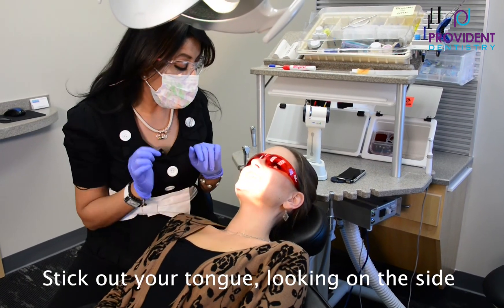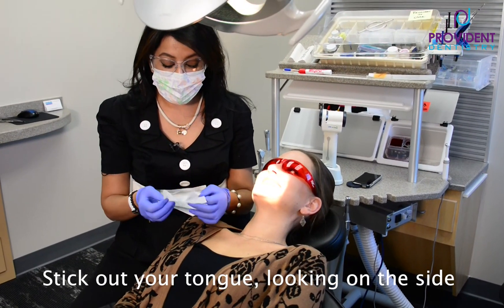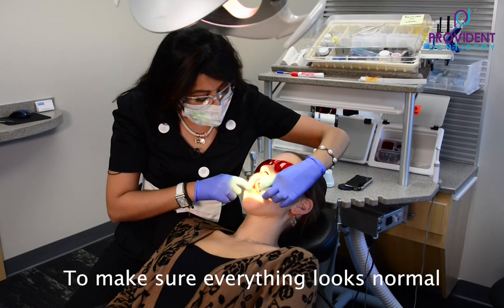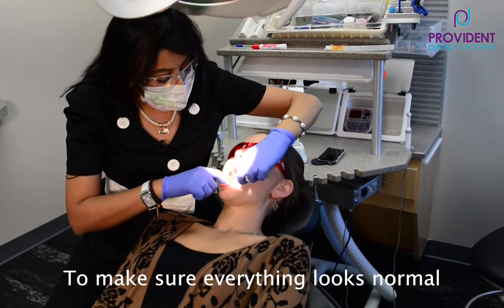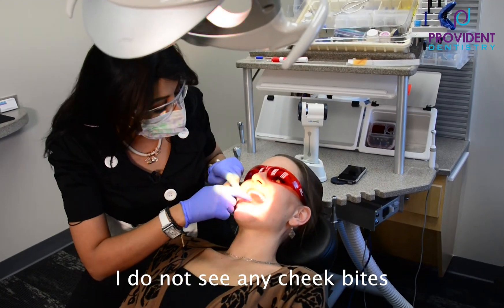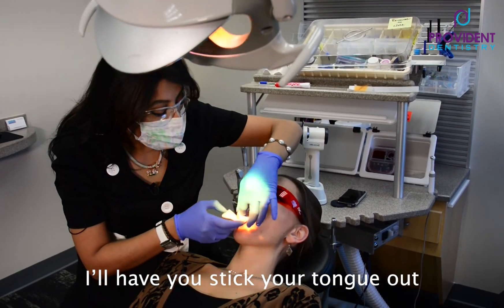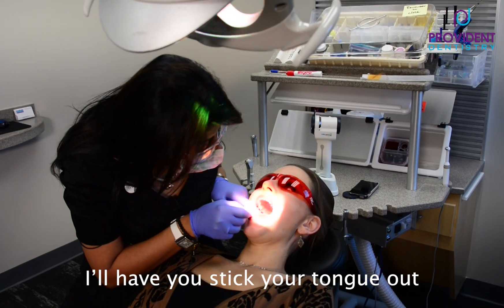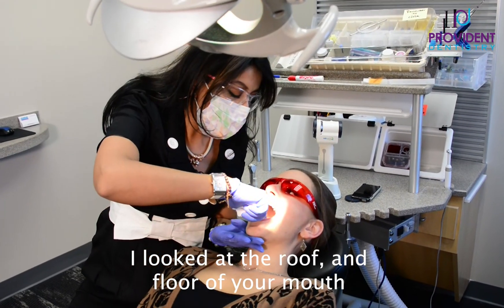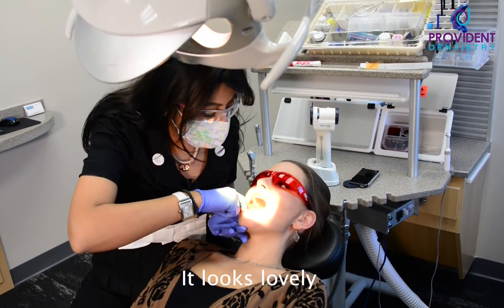Looks beautiful. Now stick your tongue out for me — in a nice way. I take a little gauze to hold her tongue, then I look at the side to make sure everything looks normal. Looks beautiful — lovely teeth. I do not see any cheek bites, which is beautiful. I say 'ah' and I'm looking at the back of the throat, the roof of your mouth, the floor of your mouth, and I press to make sure I don't feel any lumps and bumps. Looks lovely.